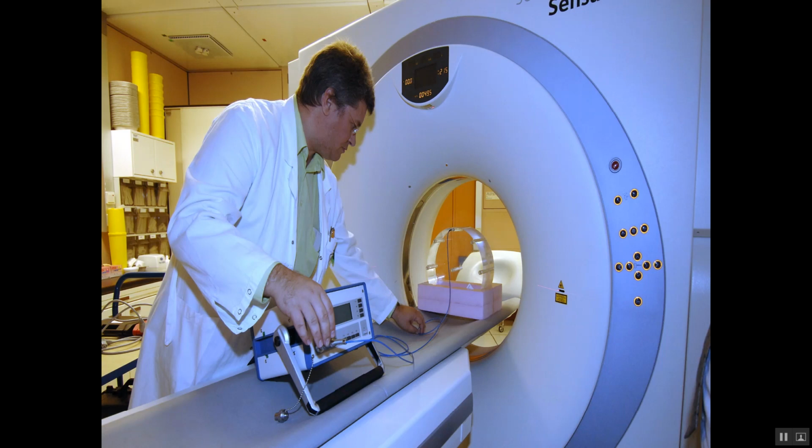We use a 16 centimeter phantom and a 32 centimeter phantom, one for head and another one for abdomen. The 16 centimeter phantom is for CT brain, the head region, and the other one is for the abdomen region, with a dimension of 32 centimeter.